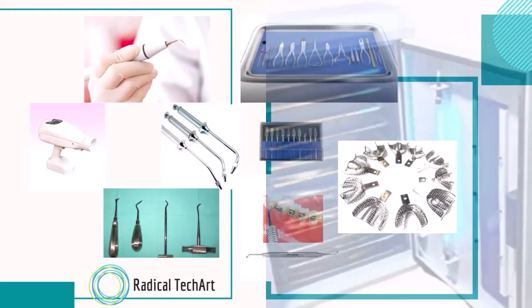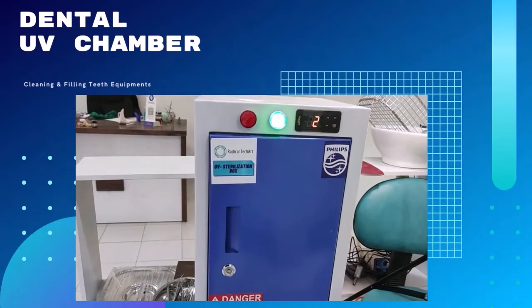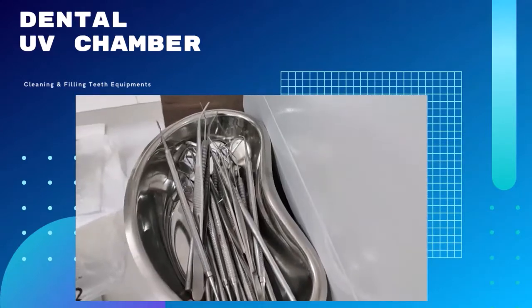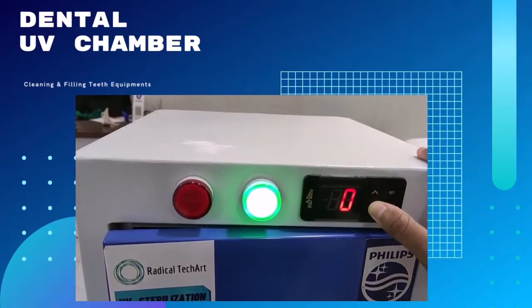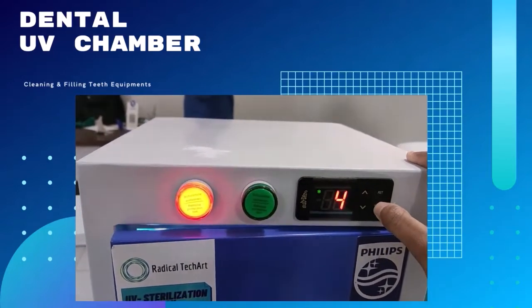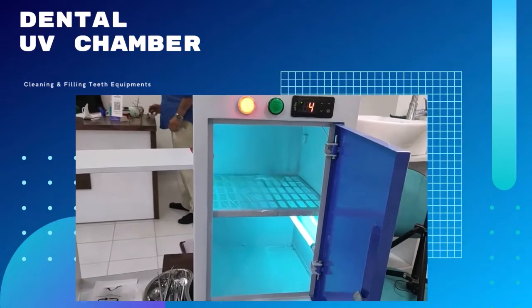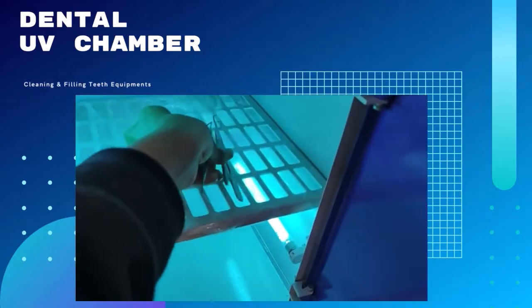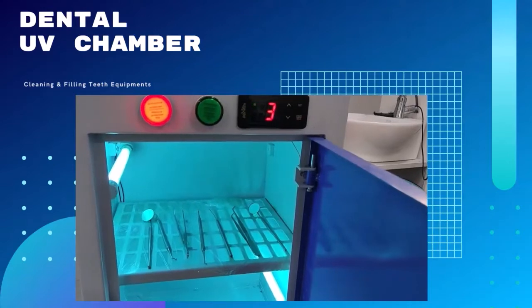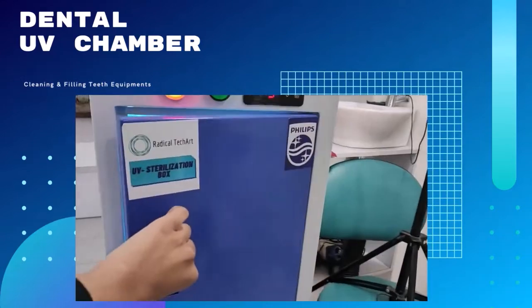All these instruments can be cleaned by this UVC chamber. Now we are going to check whether our instruments are cleaned or not. You can see the green light and the system is stopped, so we can see here that our instruments are cleaned. Now I put another instrument inside the UV chamber — like this, on the surgical tray — an oximeter. Now I again press the timer for 3 minutes and it will start. You can see the process here.